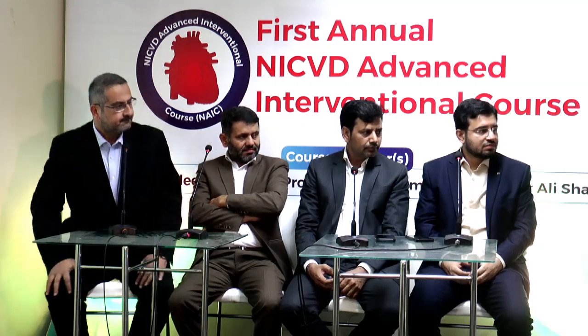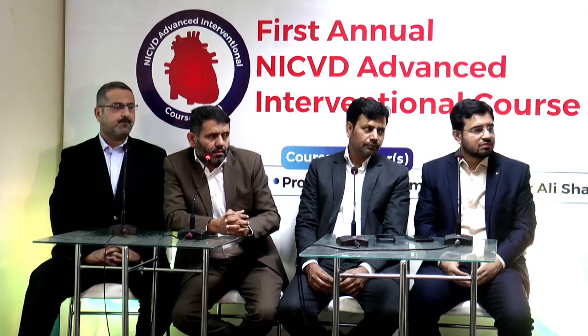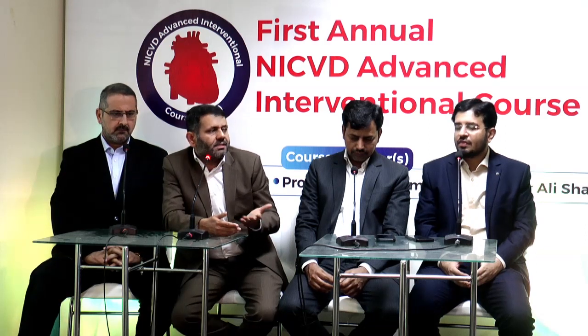Dr. Gulzar, you mentioned something about putting in an IABP. Now, in vein grafts that go up and down, where is the predominant flow in the vein graft? Is it systolic or diastolic? No, it's diastolic. I am not regarding the SVG intervention for IABP. The first part of my question is, would flow in this vein graft be during systolic? I understand your question. You are saying that IABP favors the diastolic pressure in the aorta, and in the SVG it's systolic pressure. But I am not putting the IABP in for SVG to LAD blood flow.